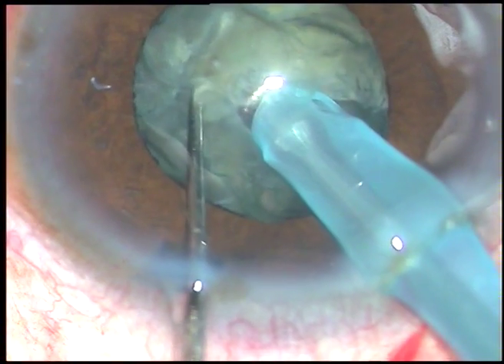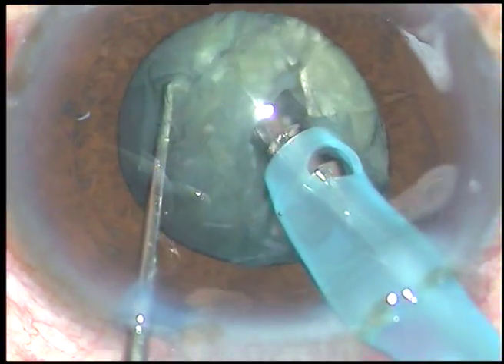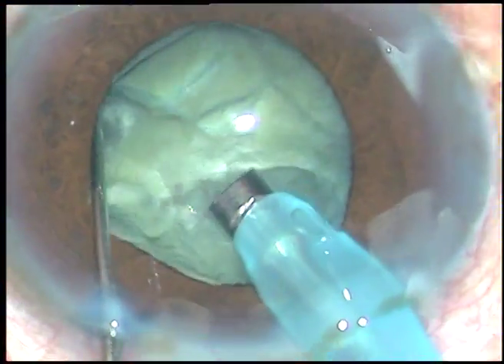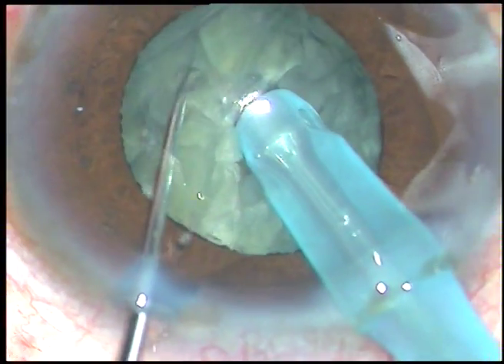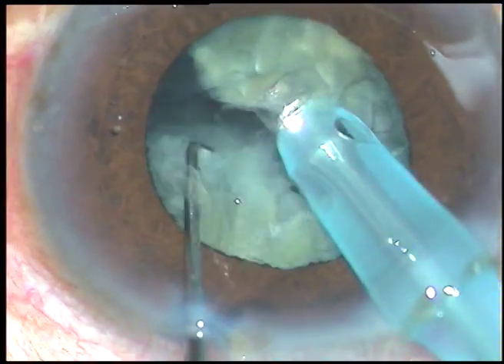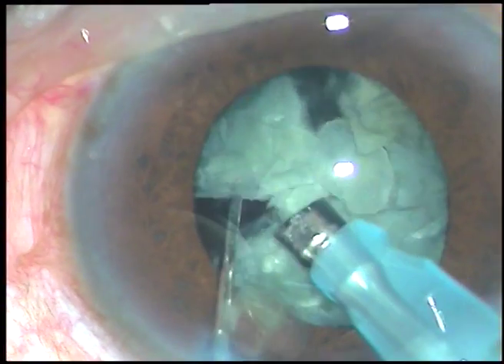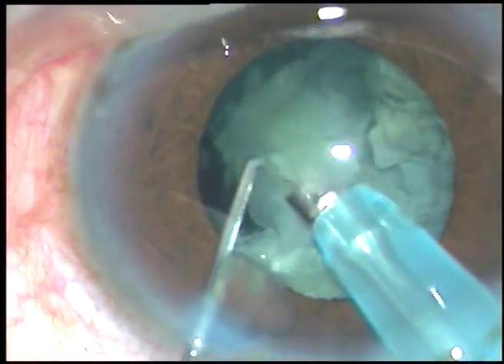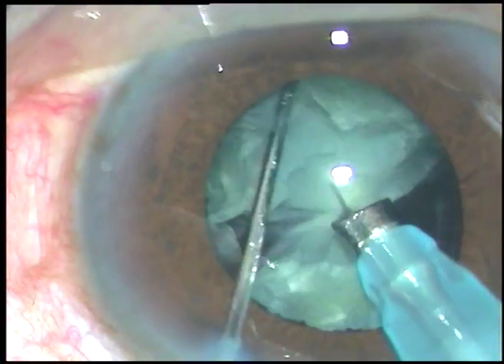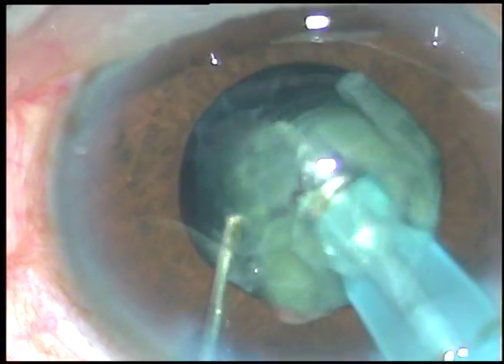The nucleus is held firmly and then it is chopped. If the pupil is not well dilated, I do vertical chop like this. The nucleus must be chopped into several fragments in a small pupil before I try to emulsify the pieces. Phaco power used in this case is 60%, flow rate is 45 ml per minute, and vacuum is 450 mmHg.